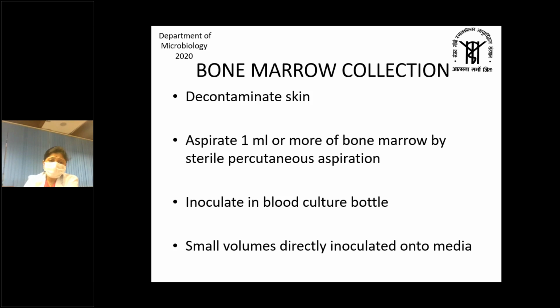So the common query usually is: when I get the bottle issued from the laboratory, do I have to keep it in a refrigerator till the time the sample is collected? No, these bottles can be kept at room temperature very easily, and all you have to do is collect the sample of the patient and aseptically put at least 10 ml of blood in each bottle.